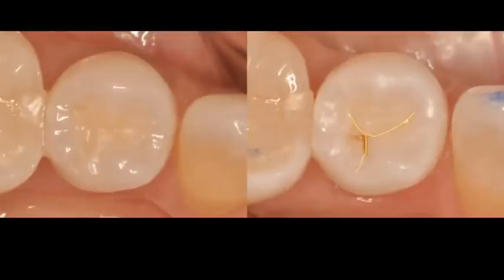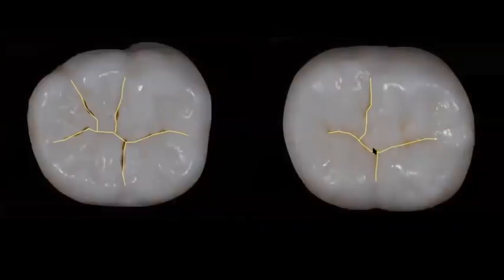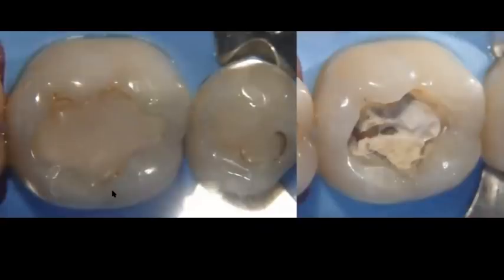We were just trying to mimic the essential lines, and we are trying to use these lines with all the other concepts that I shared with you in order for us to be able to reproduce nature. And again, you can see, depending on the tooth that you're going to restore, we're now going to restore a mandibular first molar. We're going to use the same technique, essential lines.